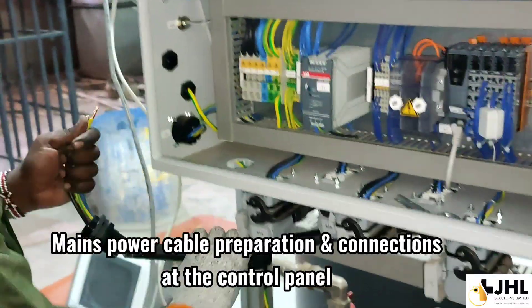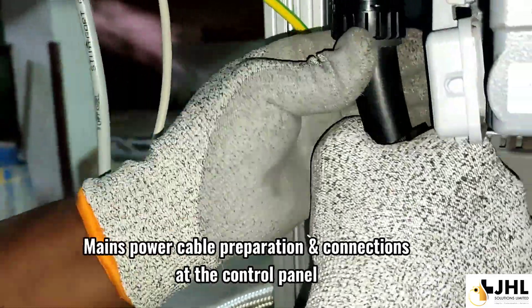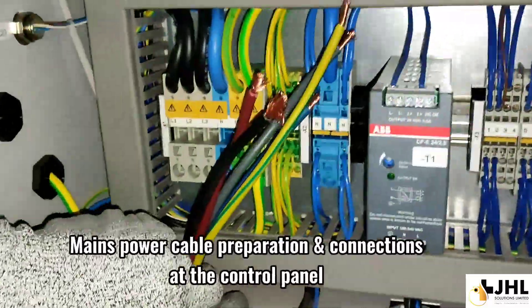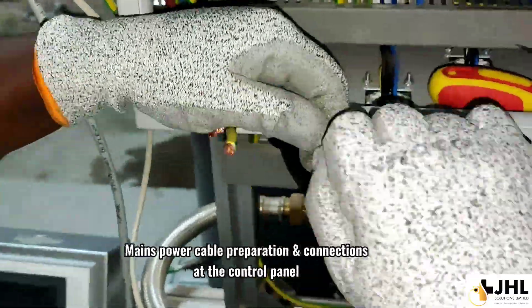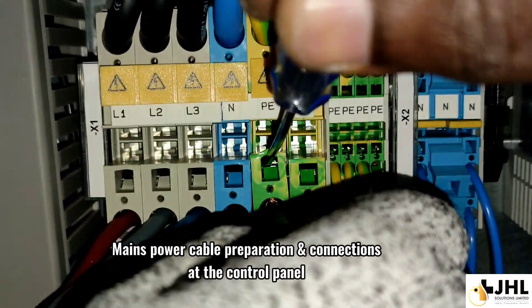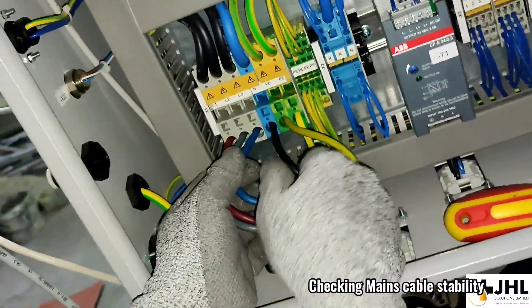Mains power cable preparation and connection. Set the control panel. Checking mains cable stability.